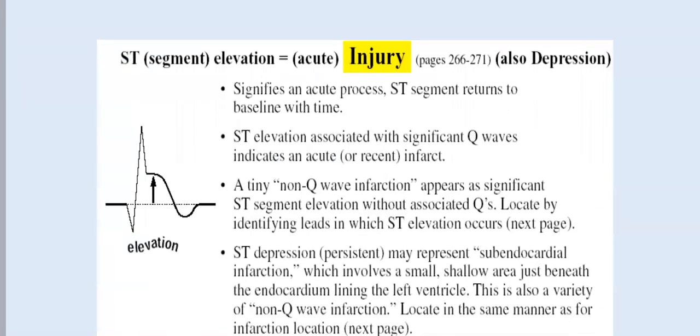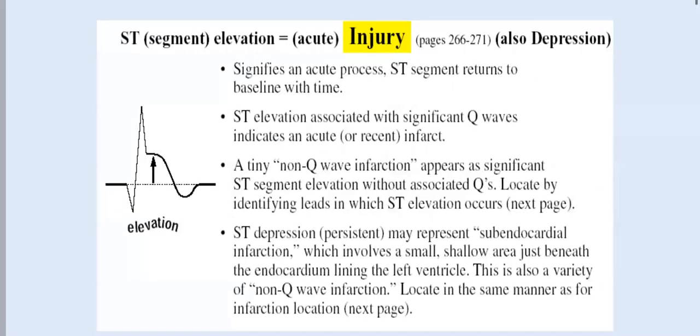Now the ST segment elevation, what does it mean? Usually ST segment elevation is synonymous to myocardial infarction. But honestly speaking, that's not so accurate, because when we talk about ST segment elevation, we talk about transmural injury. An injury could be ischemic and could be non-ischemic. So the heart muscle can come under so many injurious mechanisms, one of which is ischemia.